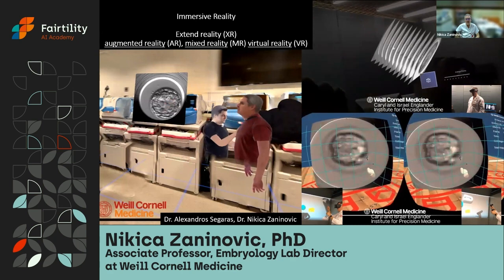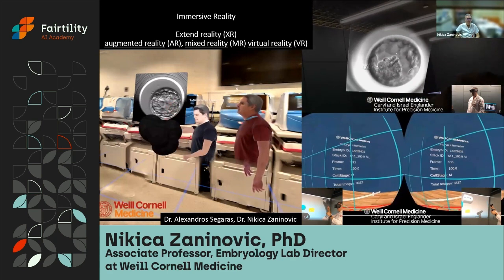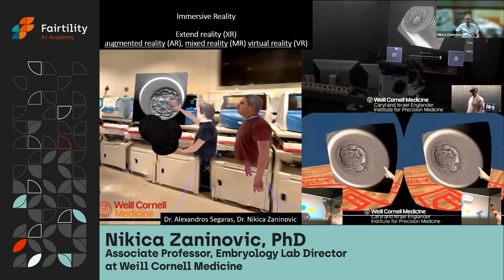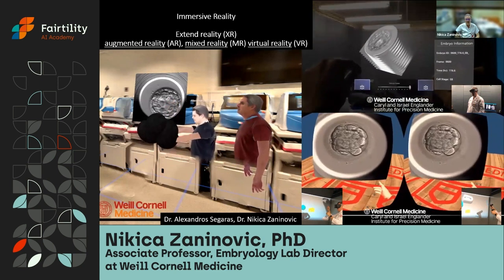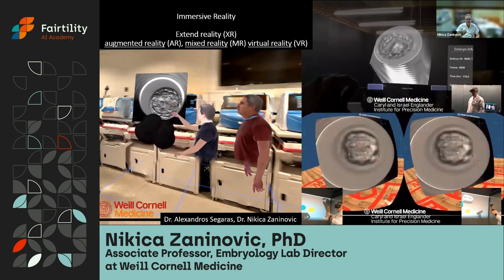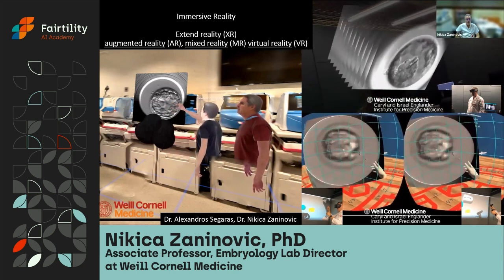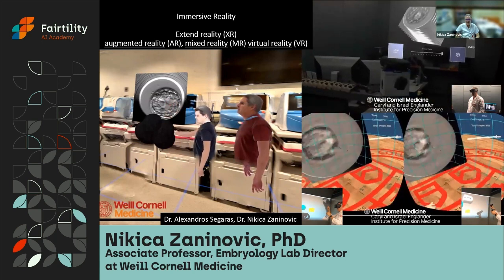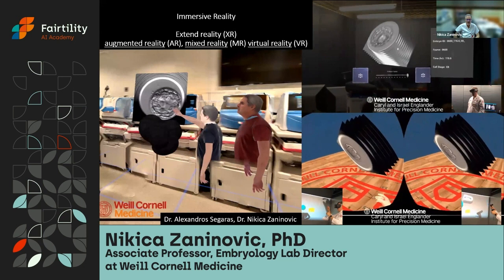It's going to be very interesting because you're not going to need to be in the lab all the time. You'll be able to take the images or the videos from the embryoscope and transform them into digital formats. You can look at them with Google glasses or with some virtual glasses and look at them in different ways. You can rotate it and look at the details. And I think this is going to be very, very exciting. This is a new technology coming up, but I think it's going to be very, very exciting.